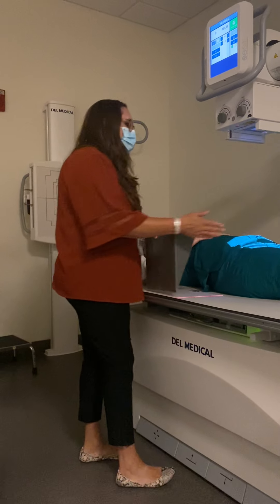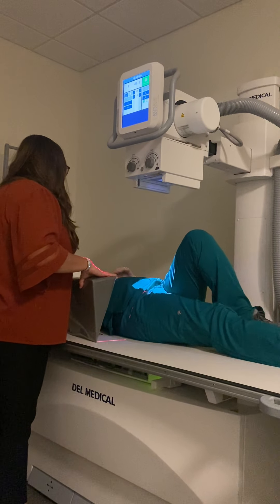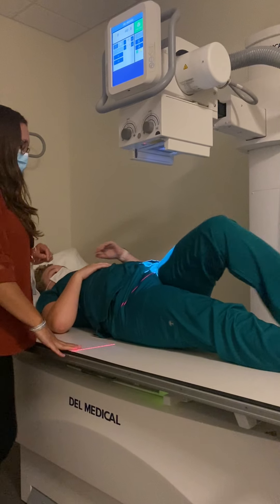What I want my patient to do is bend your left knee up and bring your left arm over, touch your right shoulder, and roll like a log towards me. I'm going to put a sponge underneath your hip, roll back onto that, and straighten that leg out.